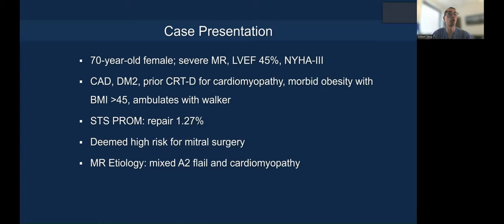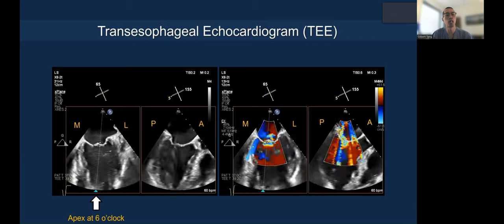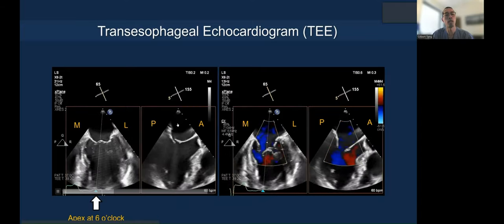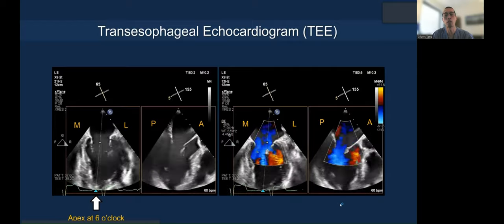The etiology is a little bit mixed — I want to show you two different scenarios. It's a mixed A2 flail, but also the patient has reduced ejection fraction. In the bicommissural short-axis view, we typically put the apex at 6 o'clock — you can see medial and lateral, anterior and posterior — allowing you to assess anatomy and identify where the jet is located.